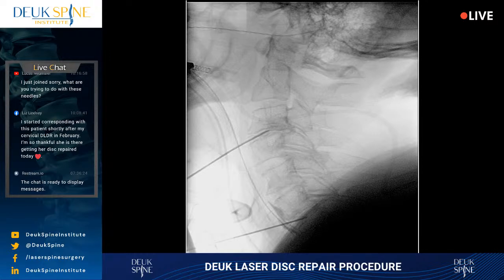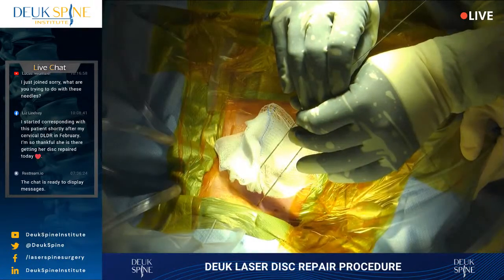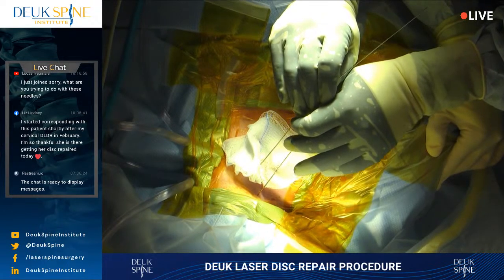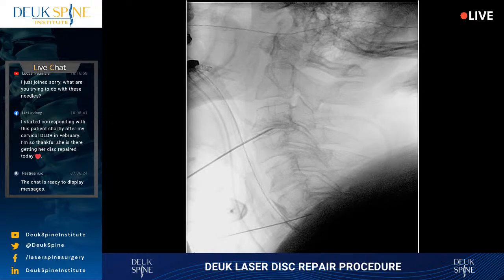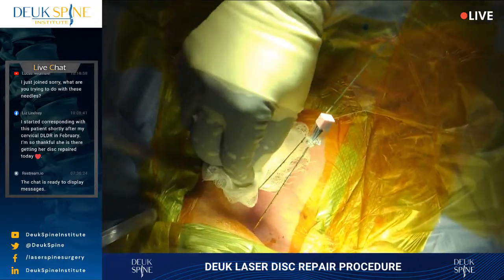Let me just see if I can see the guide wire come out. Shot. It looks like the guide wire's there. Difficult to say for sure. Shot. So I'm going to start pulling the needle back, shot, and just see if the guide wire stays. There it is. It looks like it's staying, shot. Yeah, so needle's out, guide wire's in. Now the guide wire is going to allow me to navigate to the disc with my dilator. And the dilator is going to open up things just enough for me to do the surgery.